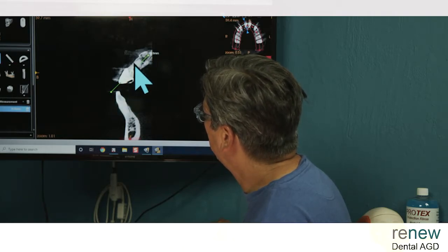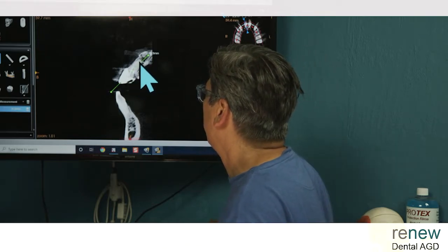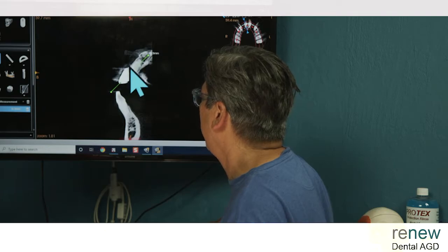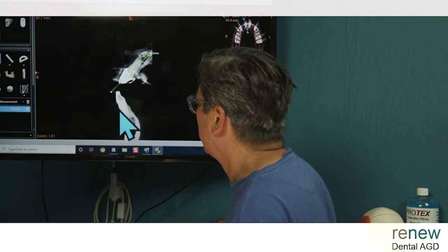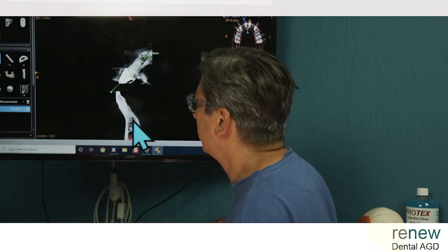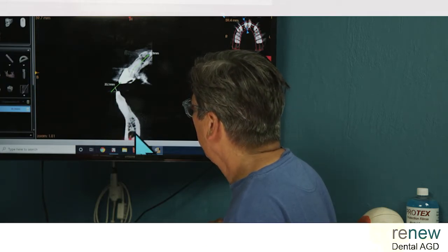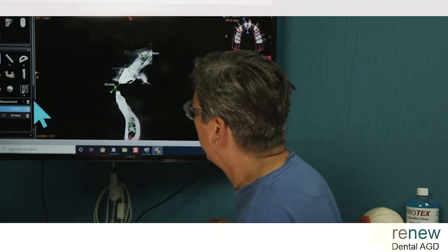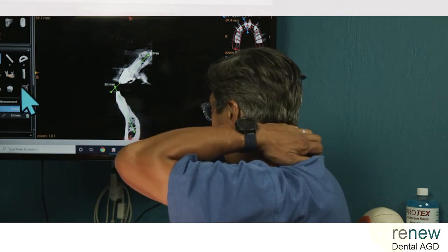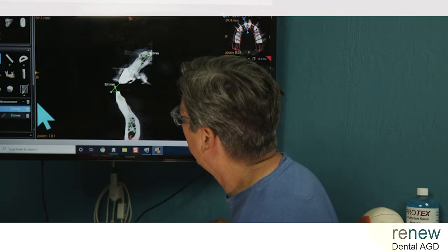His facial bone starts to wither away right here. That's worse. I would rather have the facial plate be thin here and thick here. That's a better scenario. But when it's really thin there, it's really hard. Here it's just thin all the way around. The constriction's not too bad. But look at this. That's like, man, that's like 45 degrees, or, you know, whatever. It's a right angle there. That is crazy. Let's just see what we actually have here.